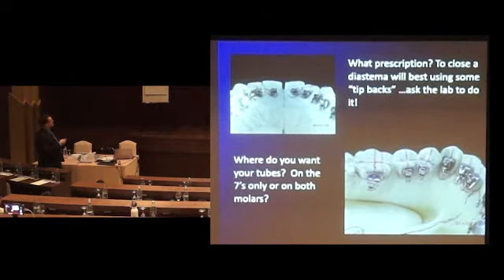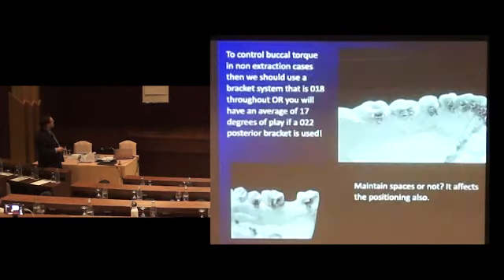I want two tubes. I want one tube on one side. I want to finish it to sixes with a tube, not a bracket. I don't want to close the space — I want to maintain the space. So we're not really going to change the angle of the slot for the tip; we're not putting any compensations on there. We're going to bond it the same as the tooth.